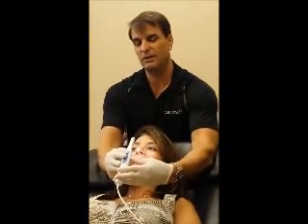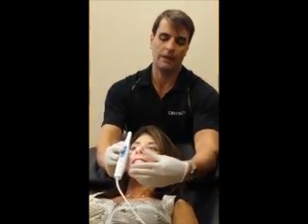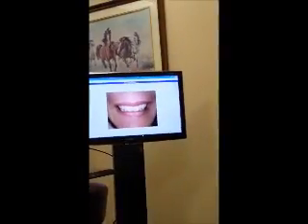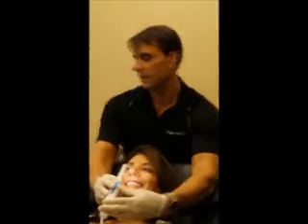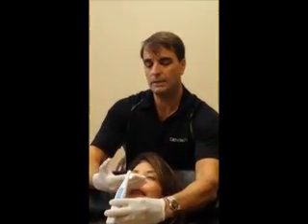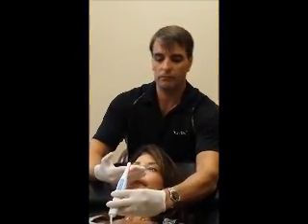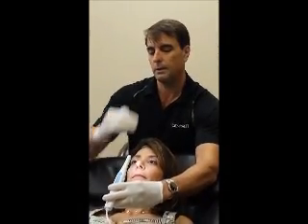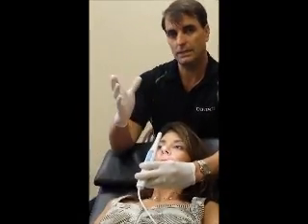It's nice and still. By stabilizing on the headrest and having my finger on the capture button at the correct distance, I'm able to get a nice still smile shot. Distance-wise, I'm about a hand's width away from the upper lip. The top of the camera is just over the upper lip, and I'm using the nose to bisect everything.